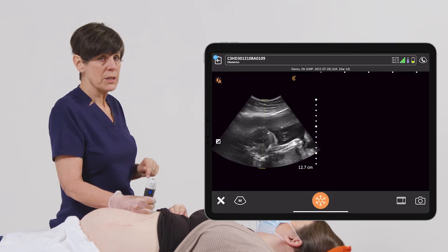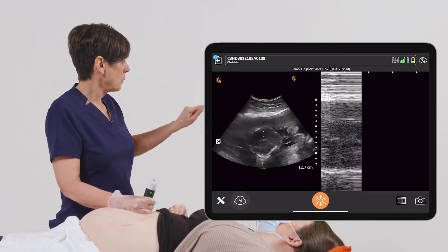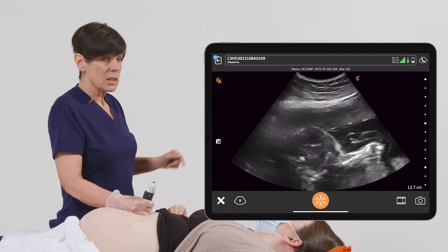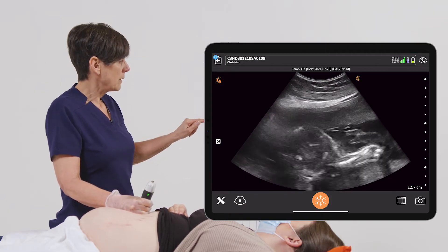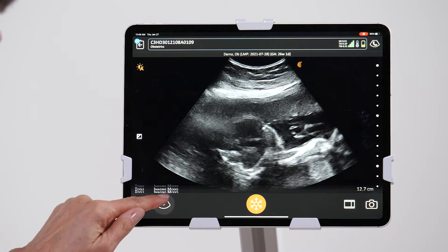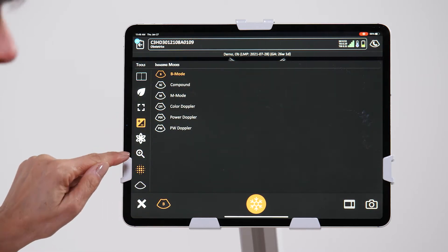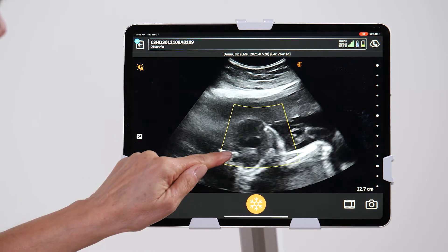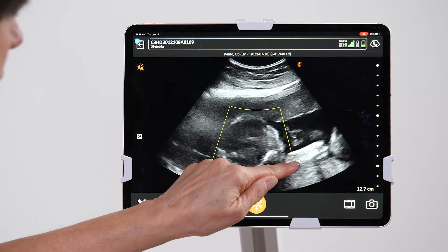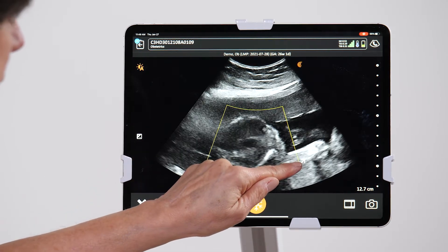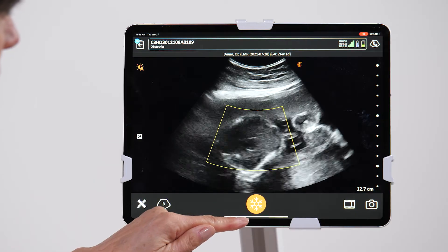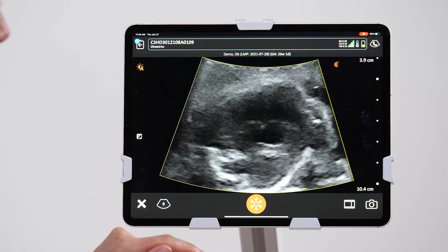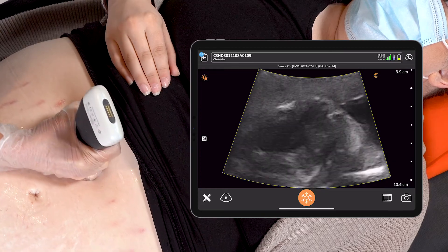I'm also going to show you a new feature that we can use called HD Zoom. Again, I've located the fetal heart. I'm going to go into the settings and choose this magnifying glass with the plus sign. That's going to give me a region that I can adjust the size of. I want to include the heart in that region. We'll double tap.